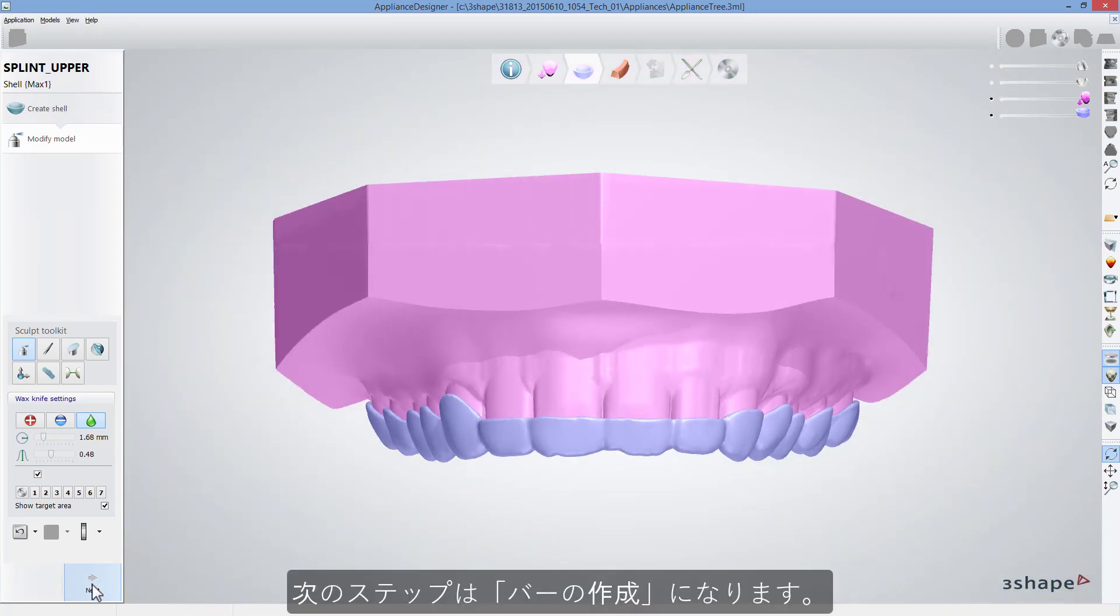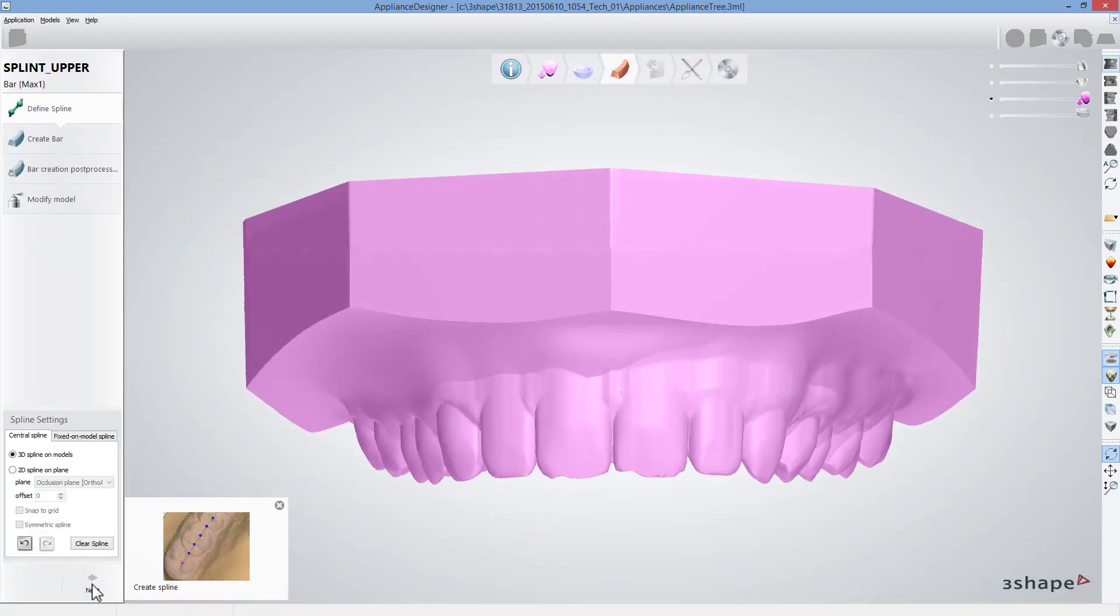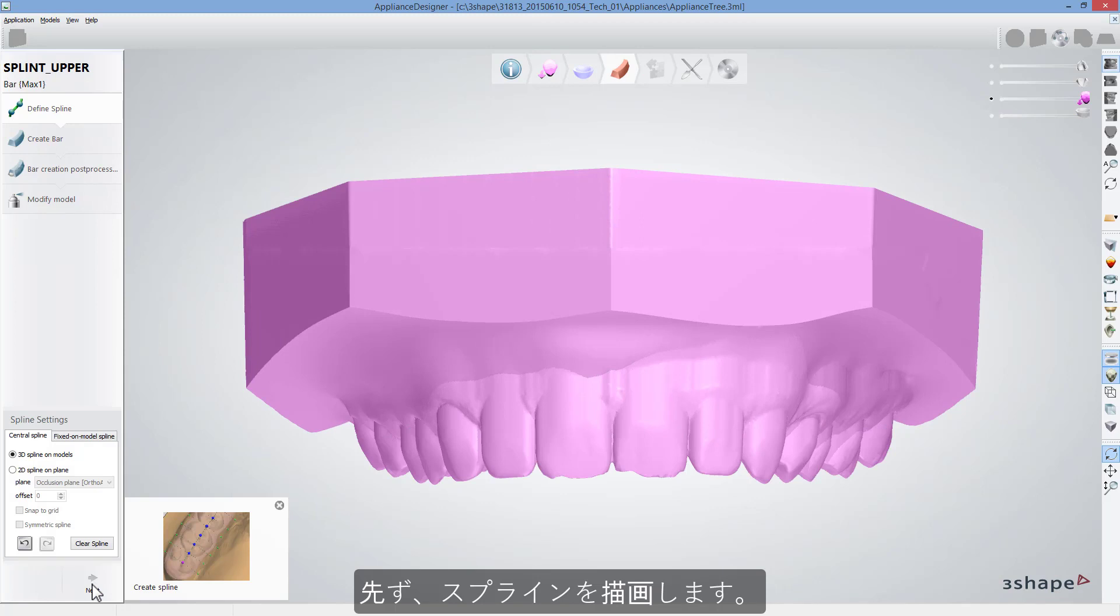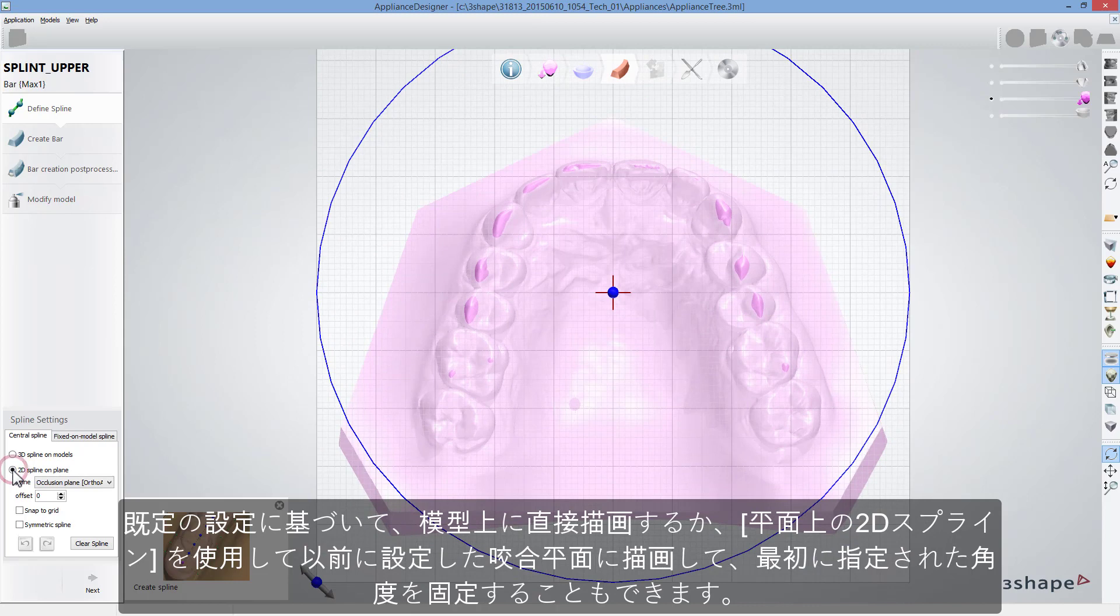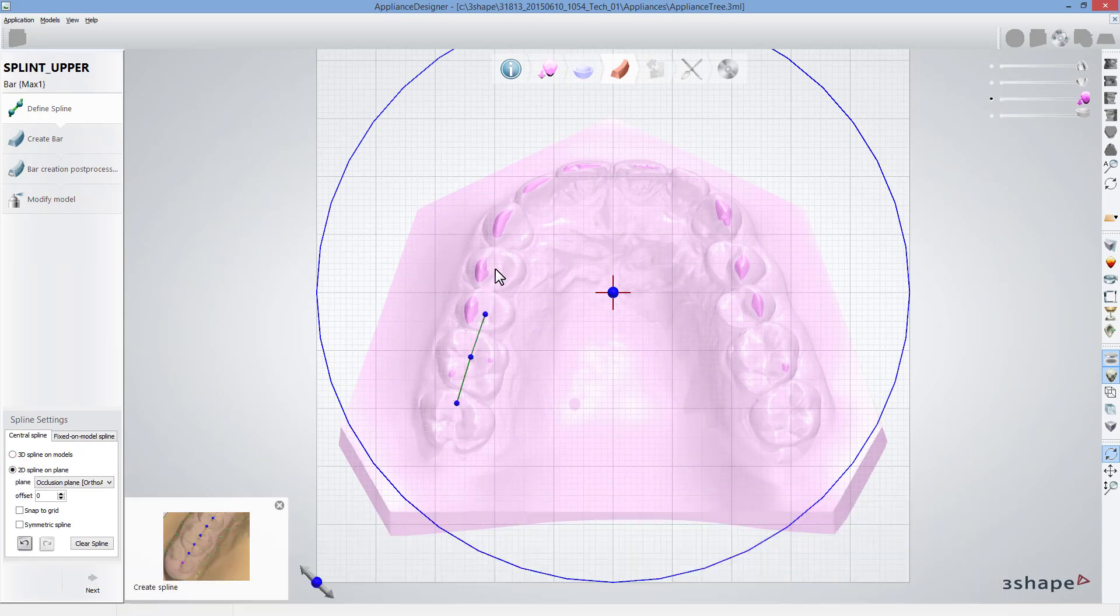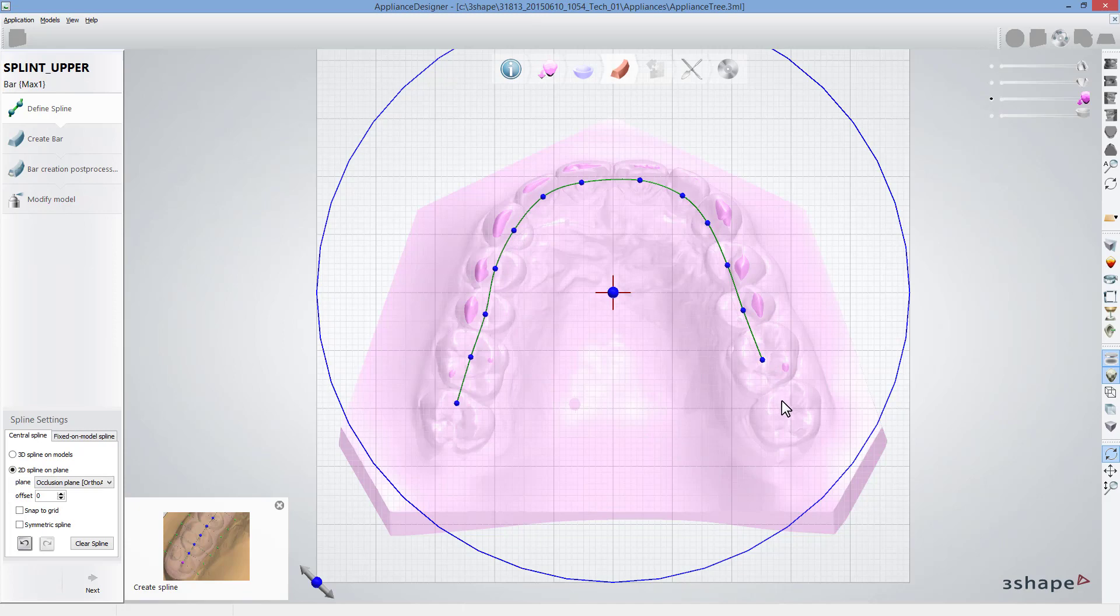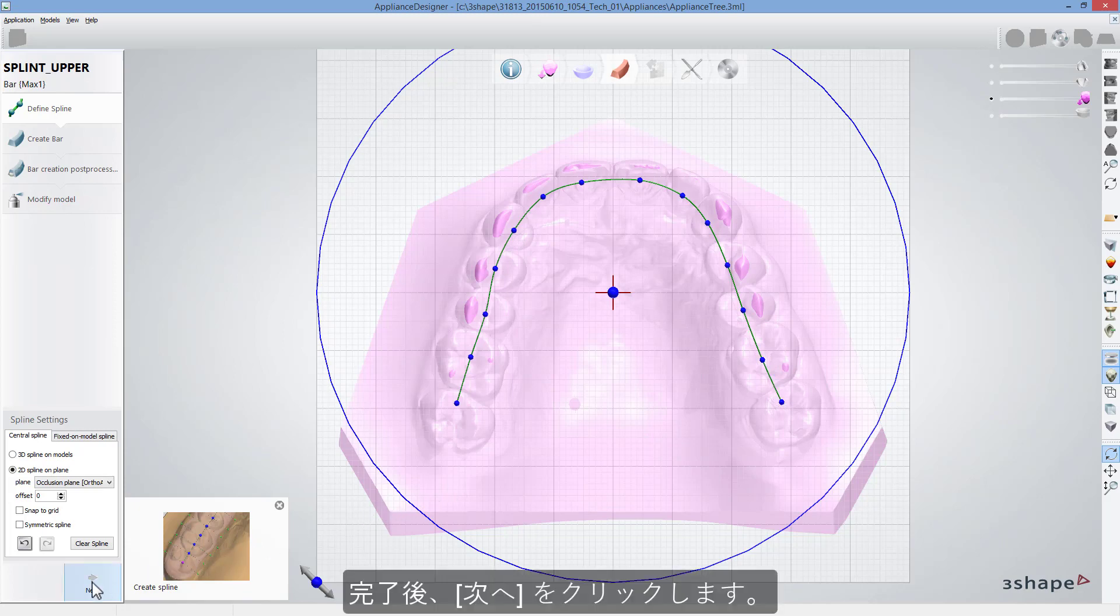Start bar design with drawing a spline. You can draw it directly on the model based on default settings or on previously set occlusal plane using 2D Spline on plane to keep the initially defined angulation. When done, click Next.